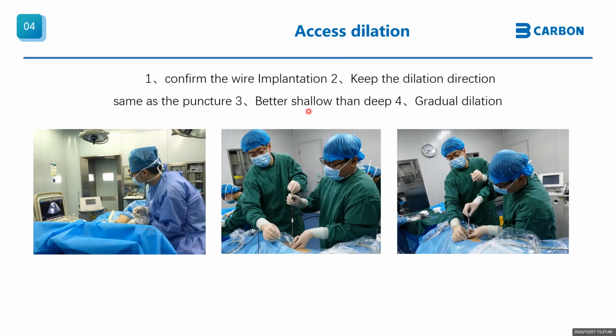And the dilation should be shallow rather than deep. If we can't reach the calyx, we can go deeper, but at the beginning, we should avoid deep dilation.